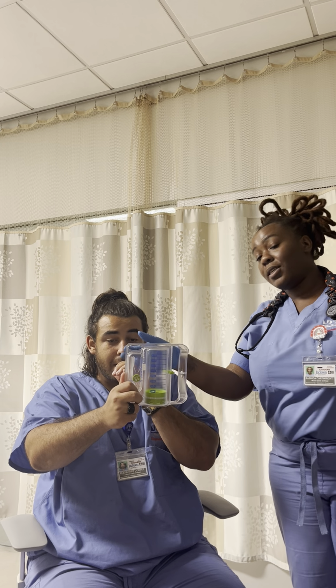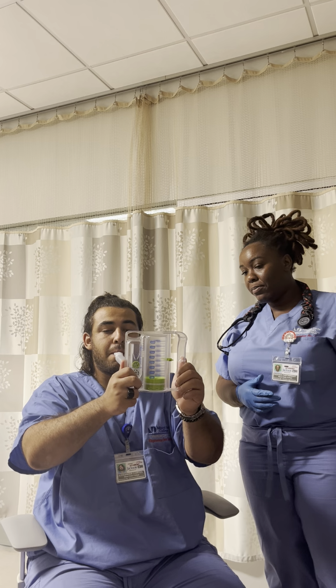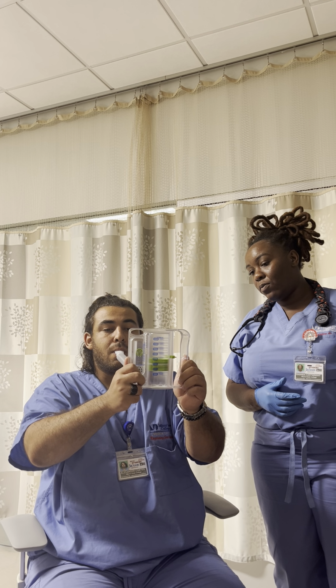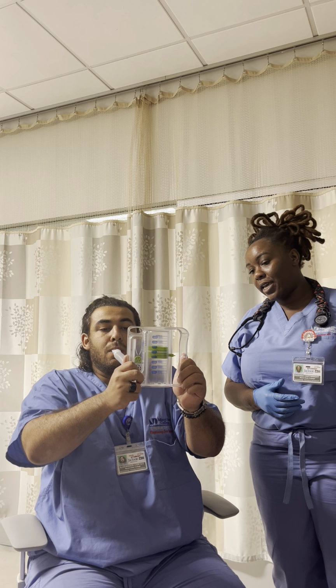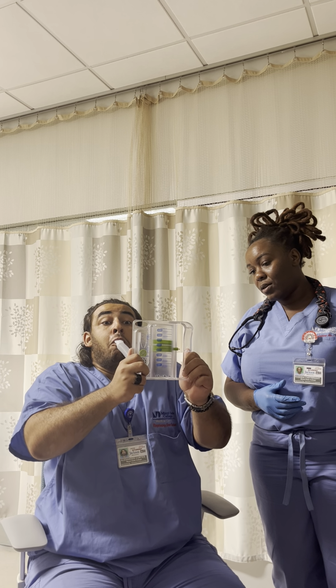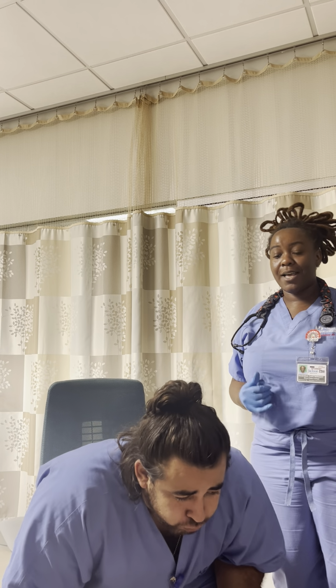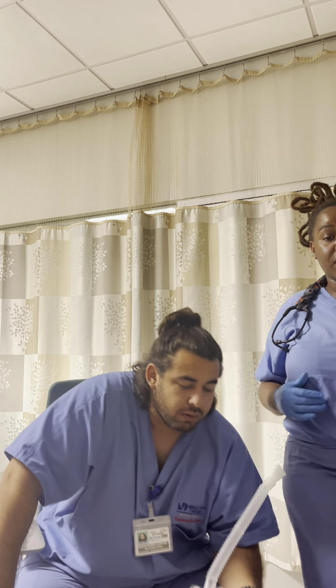Okay, so the green piston is going to go to the smiley face. Hold it in between the two arrows till you get to 2150, which is his value. Hold it for 5 to 10 seconds. 1, 2, 3, 4, 5, 6. Good job. Good job. Patient's gonna breathe normally.